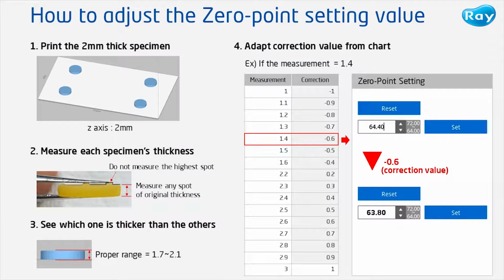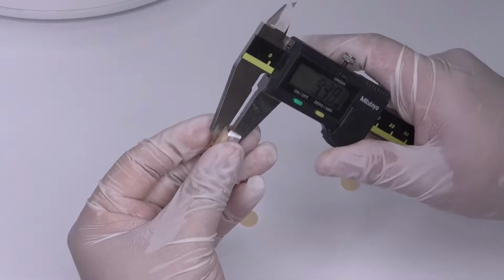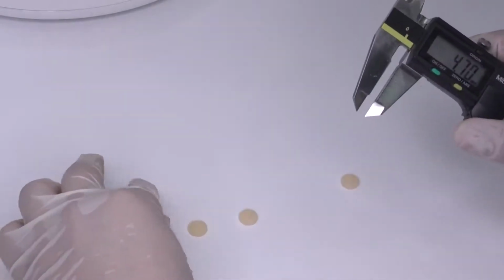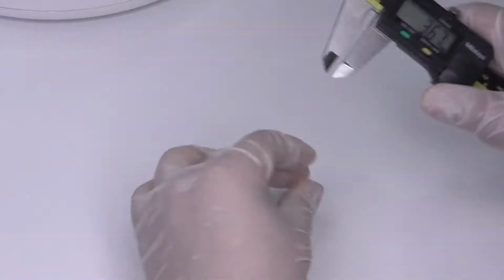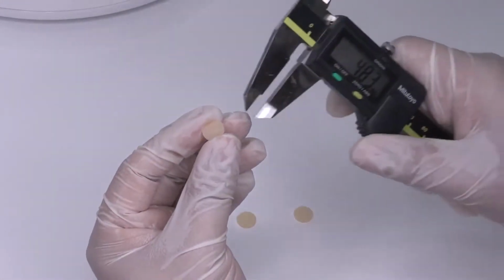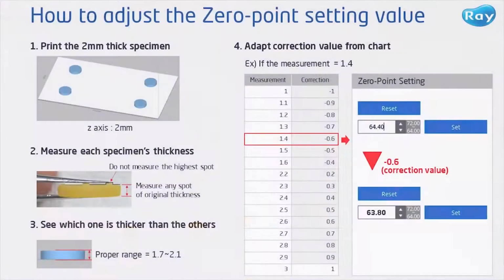First, print the 2 mm thick specimens out from the printer. And second, measure each specimen's thickness with the vernier calipers. The proper range is from 1.7 to 2.1. If the measurement is out of the range, find the thickest specimen out of 4. Next, apply the correction value to the zero-point setting.